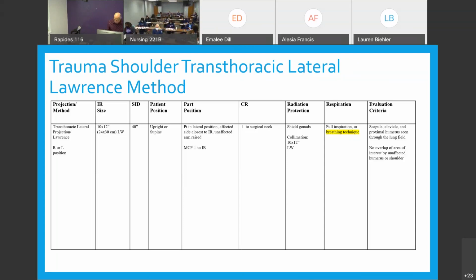All right. So that's on page 236, guys, on the third column. It says if the patient can be sufficiently immobilized to prevent voluntary motion, a breathing technique can be used to blur the pulmonary vasculature. In this case, instruct the patient to practice slow, deep breathing. And how many seconds do we need? A minimum of 3. 4 to 5 is even better. So highlight that. Remind me, we're going to teach you that in our lab today.